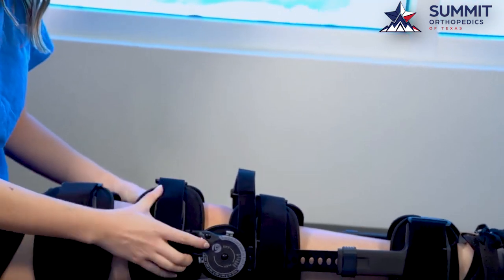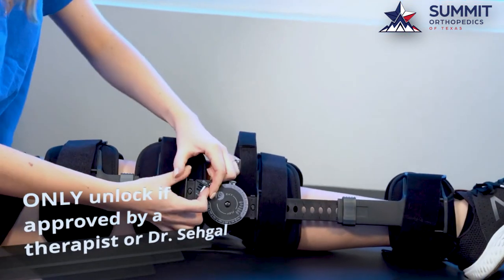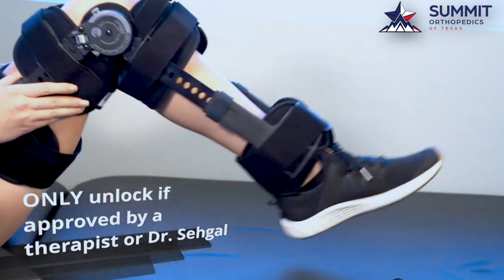Lastly, when it's time to start unlocking your brace, you'll simply push up on either side and you'll be able to bend your knee with the brace.